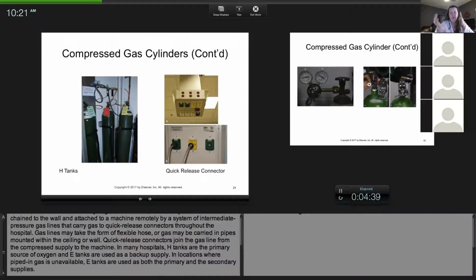So you always have the tank you're using. You should always have a backup tank, maybe multiple backup tanks, and then your empty tanks. Every time that it's empty, you have to mark it. You have to change the tag. Usually wherever the oxygen is kept, we have tags. If I emptied a tank, I would put a hook on the tank and it would say empty. That way someone knows that.